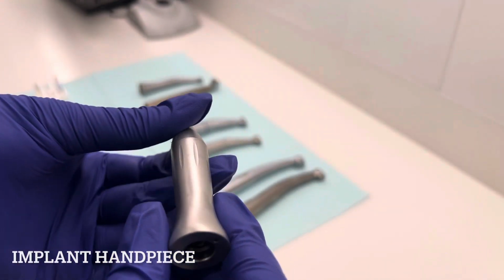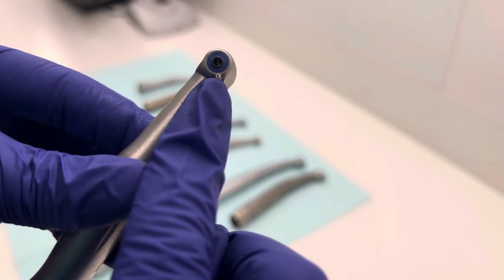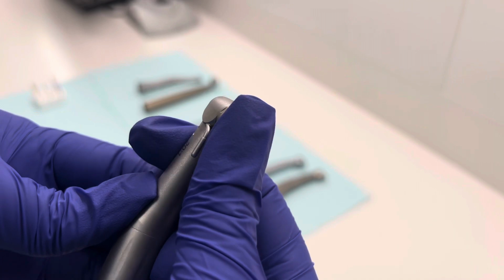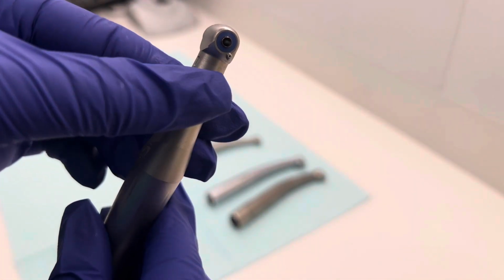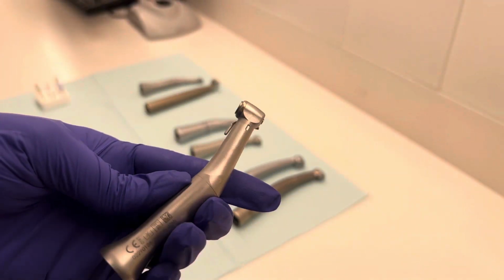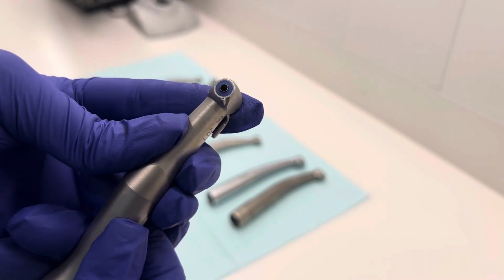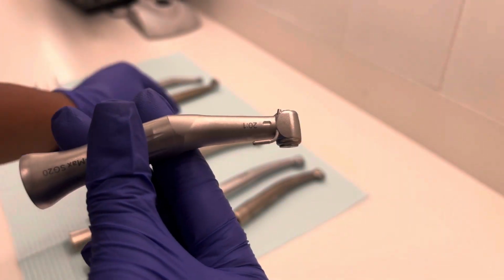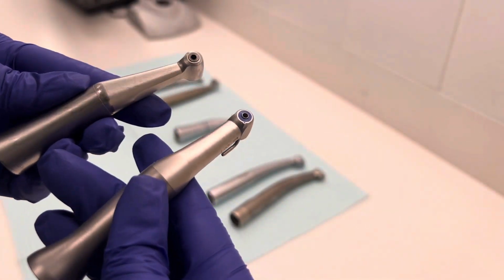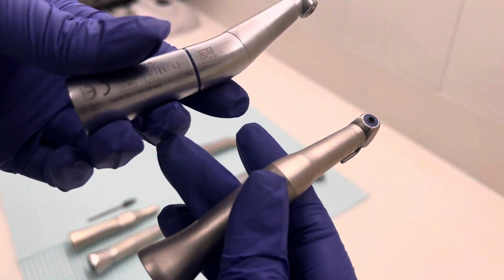This right here is an implant handpiece, which has been specifically designed for oral and maxillofacial surgery. As you can see, it has the small nozzle and the insert for the tubing for irrigation during surgery. It does look similar to the slow speeds, and it definitely can be confused, but the nozzle is the easiest way to tell the difference. We will be making a video later showing you exactly how to set this up for a procedure that is going to use the handpiece. And this is me showing you the differences. Very similar, but it's also easy to tell the difference if you know that one of them has a nozzle for irrigation.